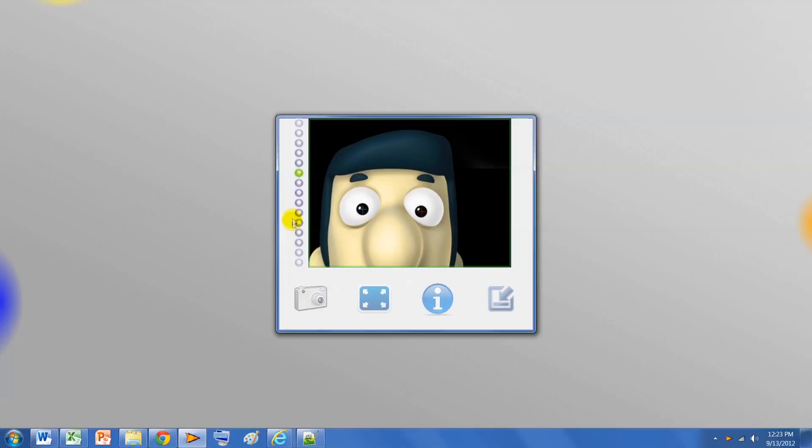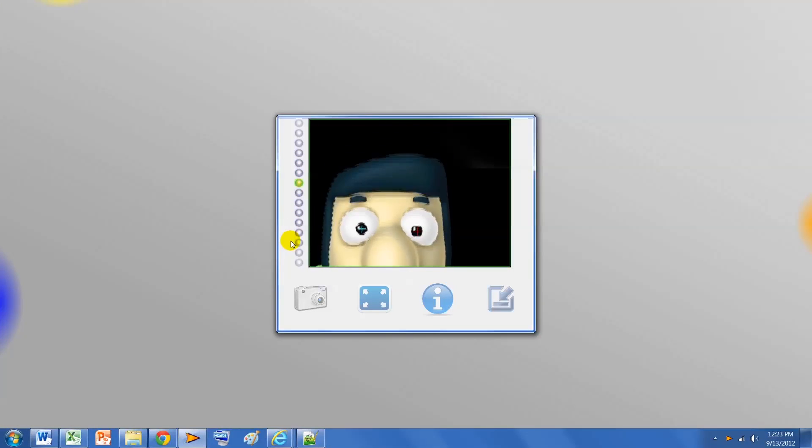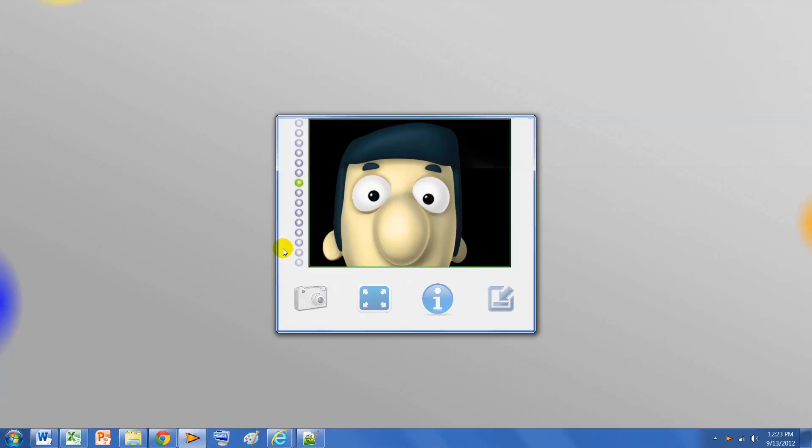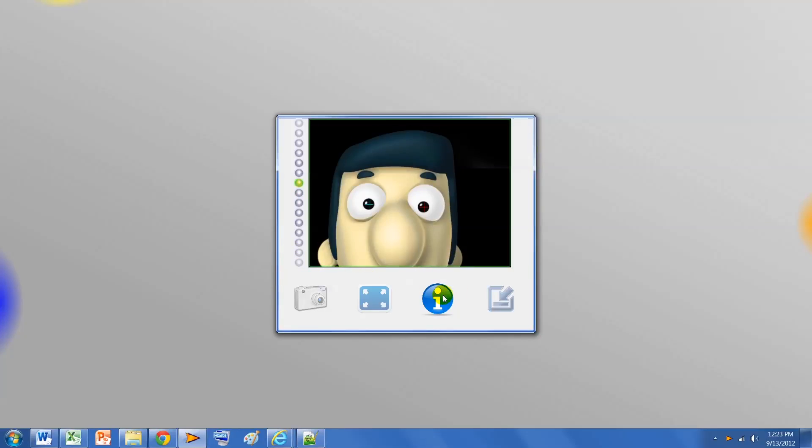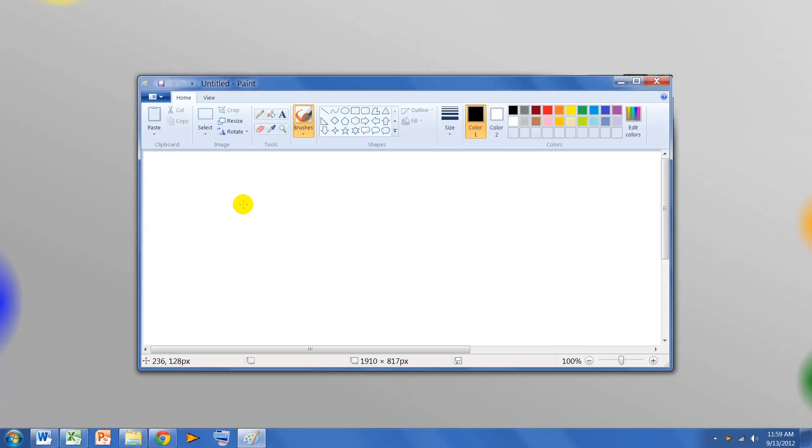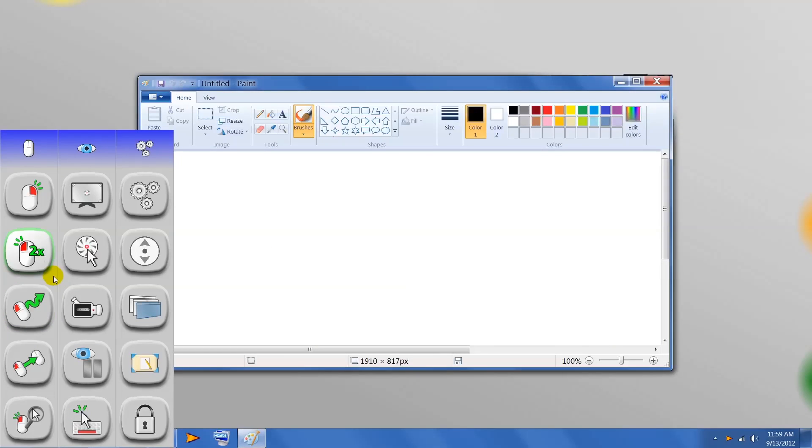Seeing is believing, so let me show you a few live examples so you can see how Quick Access enables incredibly fast and efficient eye control computing. Here in paint, I can easily use my click and drag tool from my blue hotspot.